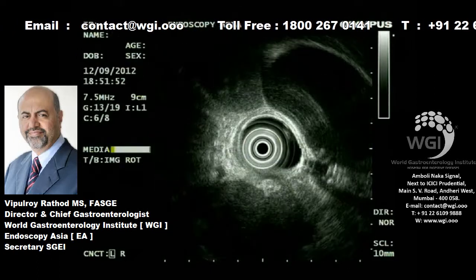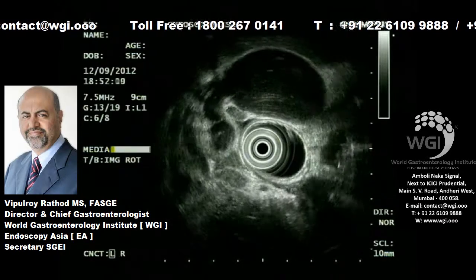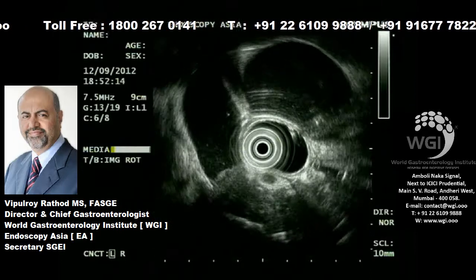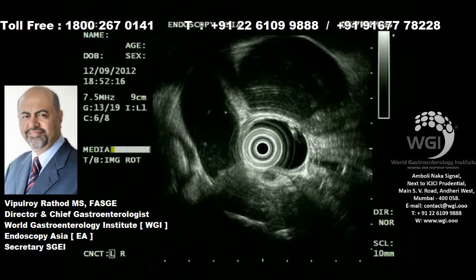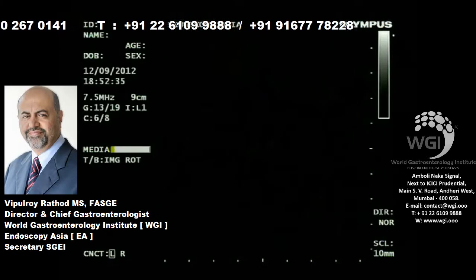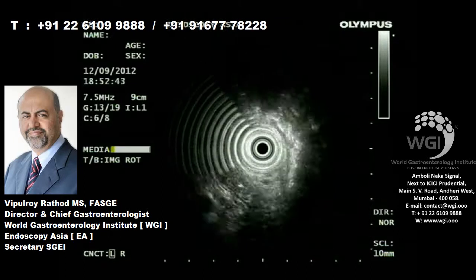The tumor is taking away all the energy there, and you can see that the bile duct is occluded with massively dilated CBD. Few peripancreatic hypoechoic nodes were seen. Echogenic bile was also seen, suggestive of a mild episode of cholangitis.